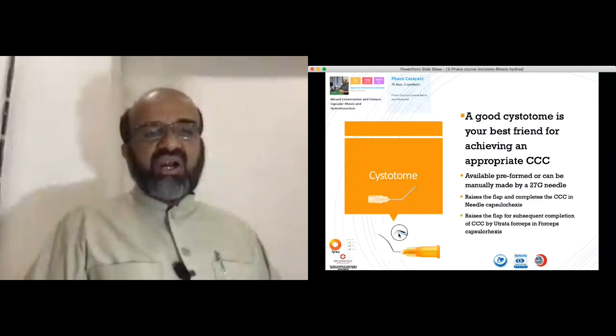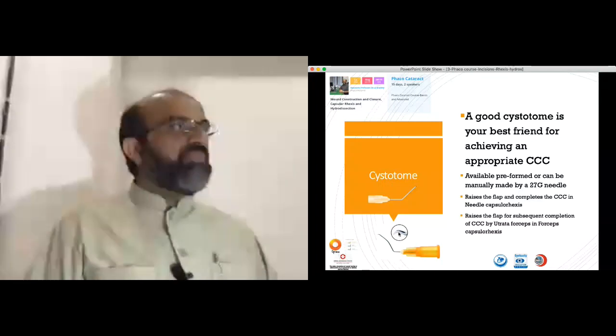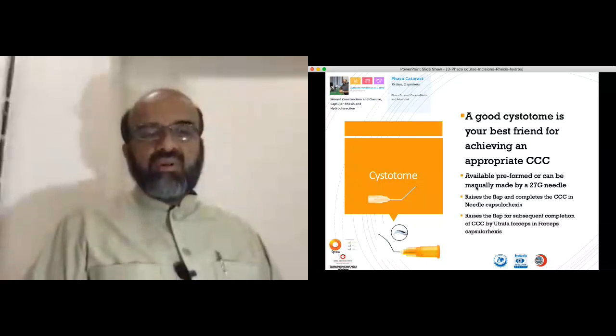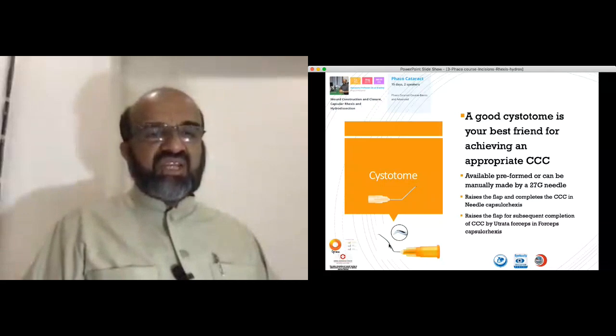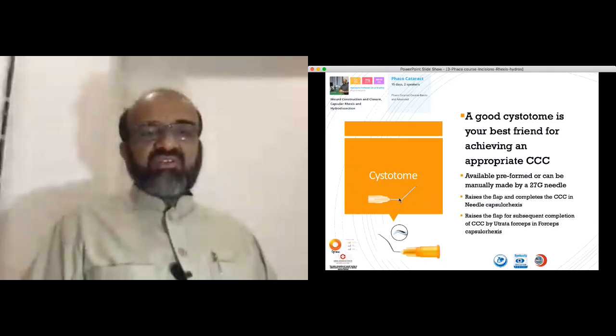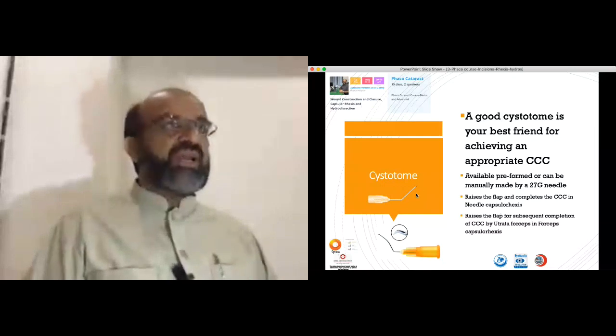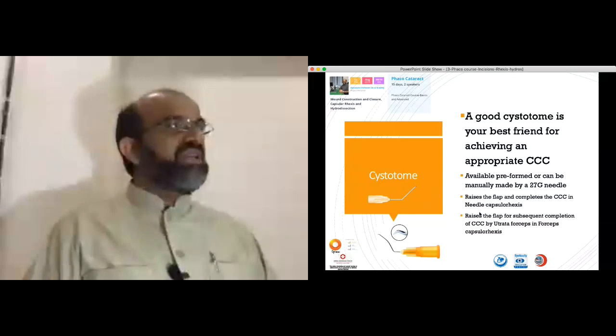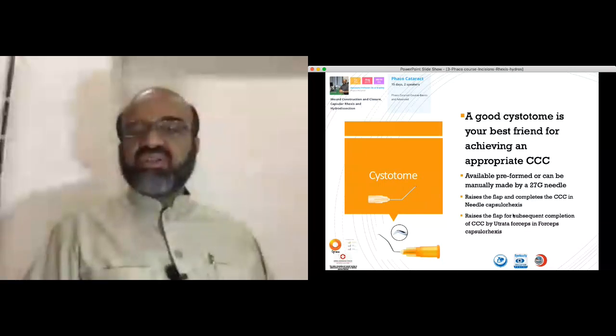And as you see, half of the bevel is bent here in this magnified view. And here it is straight, and here the surgeon has given a little central bend as well. I prefer the above one, just 2 angles. A 27 gauge or 30 gauge needle can be used for this purpose.